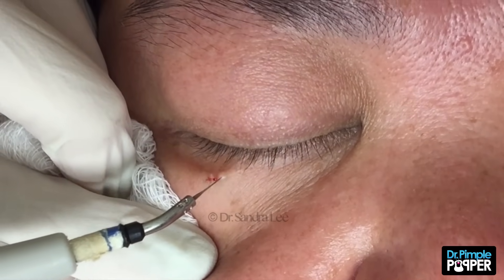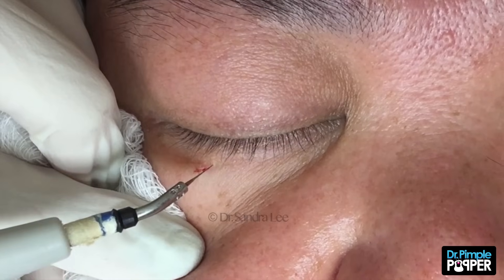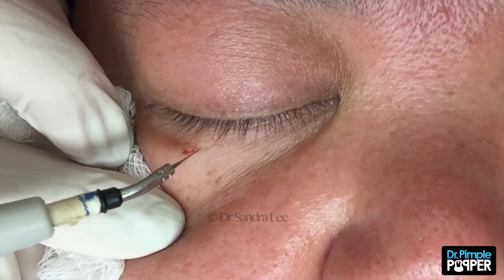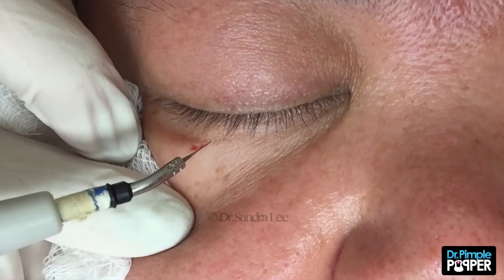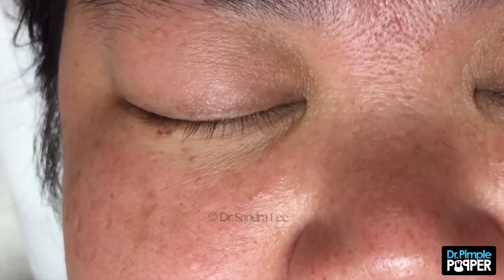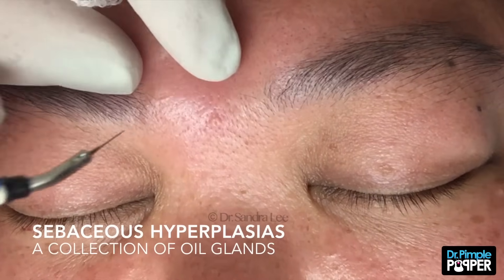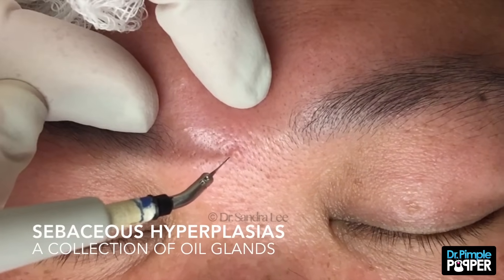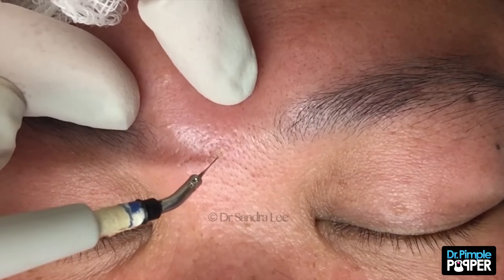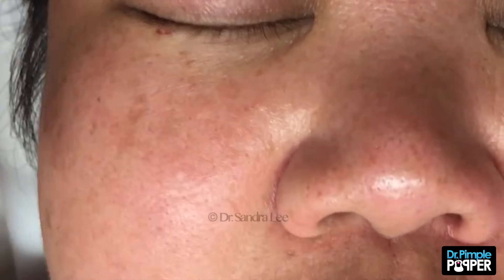That medial one — the one more in the middle — it's a little bit bigger. This kind of causes them to expel a little; it's like if we dry them up a little bit, they kind of shell out. I'm getting it extra so I know it's gonna shell out. This is at a very low setting that we use. Got it. Just relax for a minute. I'm gonna move over to the center here and do the same thing. There's no numbing because it's not right under your eye, so it's gonna feel a little pinch right here. This can sort of melt it or shrink it a little bit, and you might get a little fine gray scab — not scar, sorry. These should just fall off on their own.